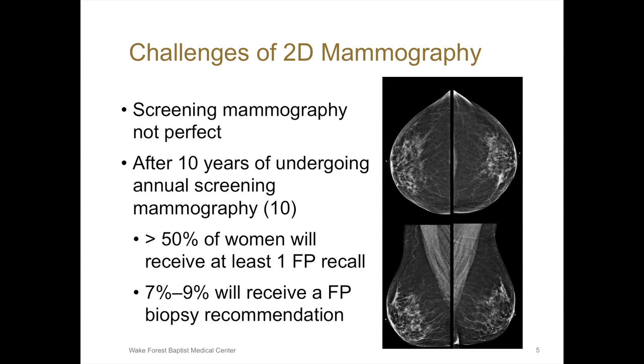So what are the challenges of 2D mammography? Well, unfortunately, screening mammography is not perfect. After 10 years of undergoing annual screening mammography, over half of women will receive at least one false positive recall, and 7 to 9% will receive a false positive biopsy recommendation. So this can cause a lot of anxiety, and we want to do better.